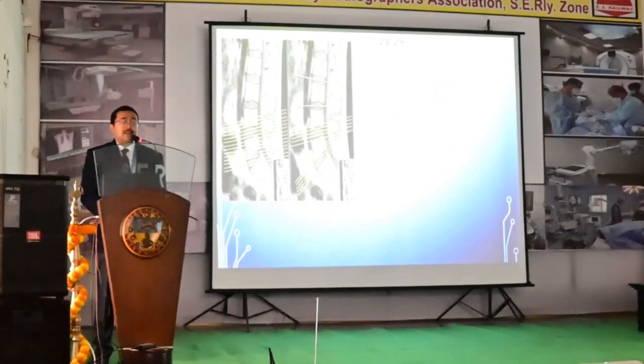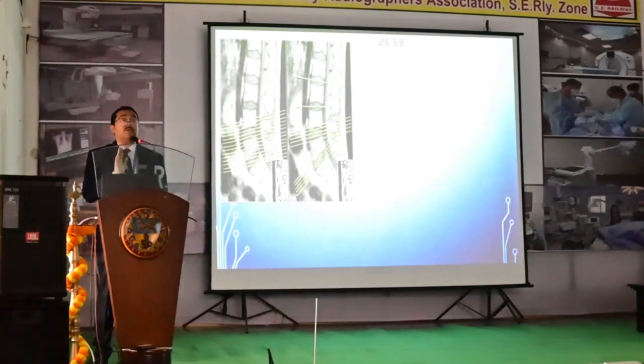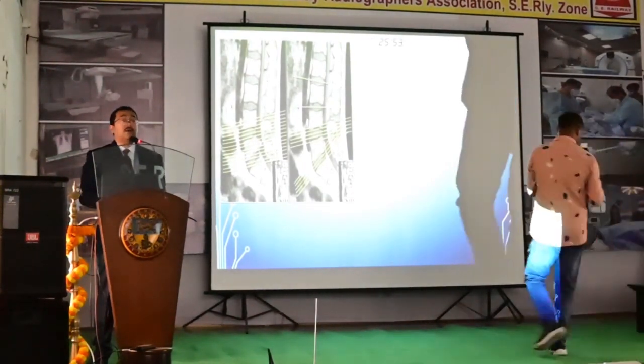And regarding the axial segment, some institutions do the continuous axial segment, but some institutions do the axial segment according to the disc level. But continuous is always better than this discrete level. It takes more time, and more films should be given. That's why the private setups usually do it in a static way, differently for each individual disc. But it should be parallel and continuous from above downward to give you a continuous segment. And in the continuous segment, we can trace the nerve root properly, not in the discrete segment.